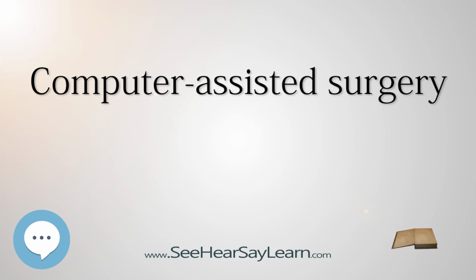Computer-assisted orthopedic surgery, CAOS. The application of robotic surgery is widespread in orthopedics, especially in routine interventions, like total hip replacement or pedicle screw insertion. It is also useful in pre-planning and guiding the correct anatomical position of displaced bone fragments in fractures, allowing a good fixation by osteosynthesis. Early CAOS systems include the HIP NAV, OrthoPilot, and Praxim.